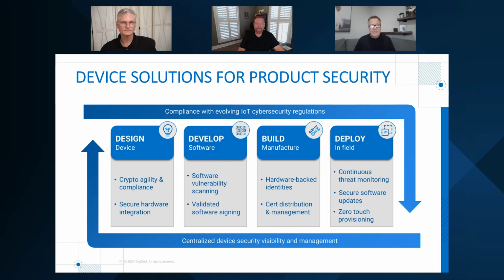A lot of people think zero touch has not much to do with security, but it does as well, right? The fewer people touching the device, the better. If you have to have field techs going to hospitals with a laptop and a USB stick in order to provision that device, that introduces potential areas of vulnerability and weakness. And then are we now monitoring those devices over the lifespan of the device? Are we monitoring the SBOMs and notifying our customers that, hey, there's an exploit now for a library we used and we have to patch it, and then securely patching the device and doing that over and over again for 5, 10 years, whatever that lifespan of the device is.